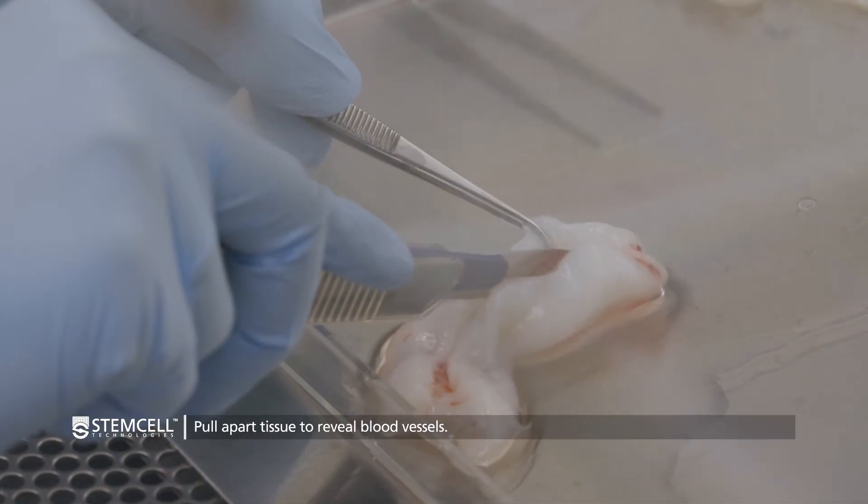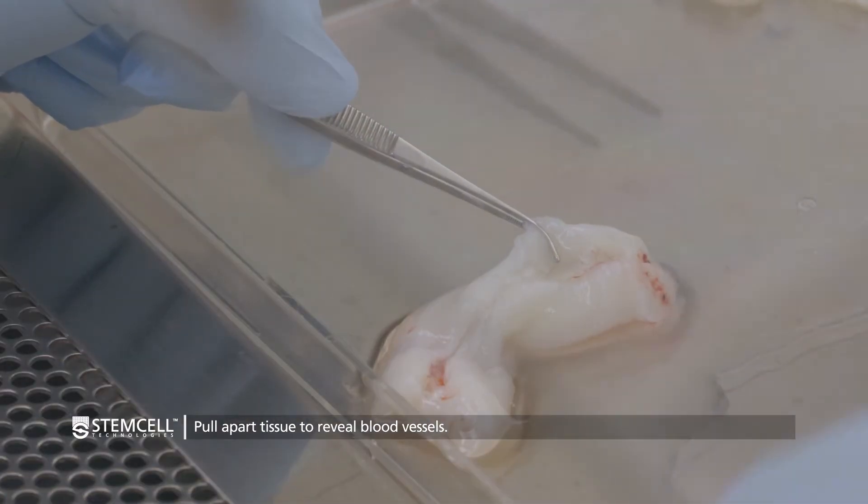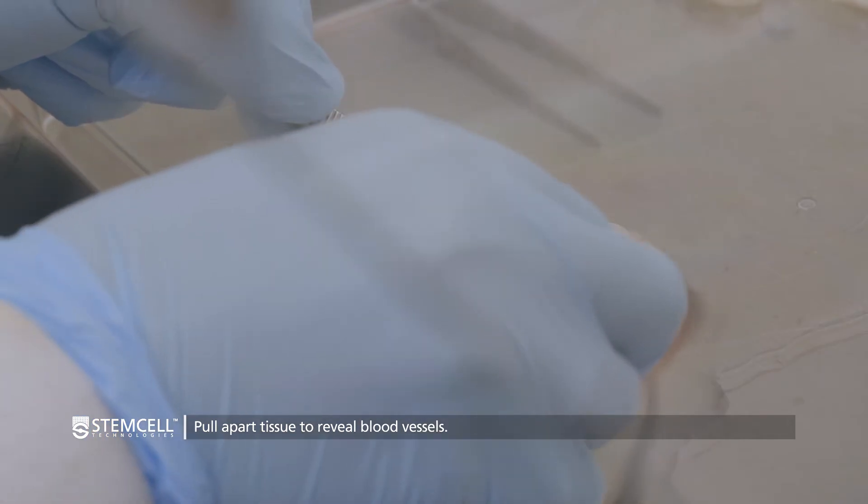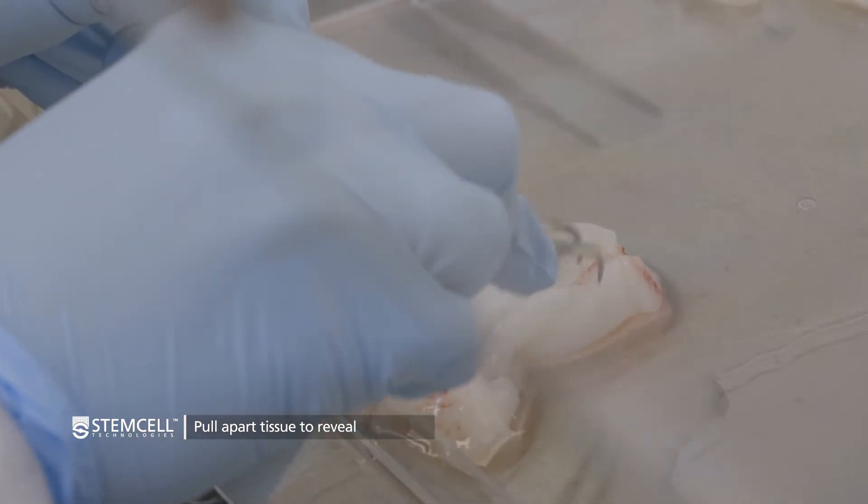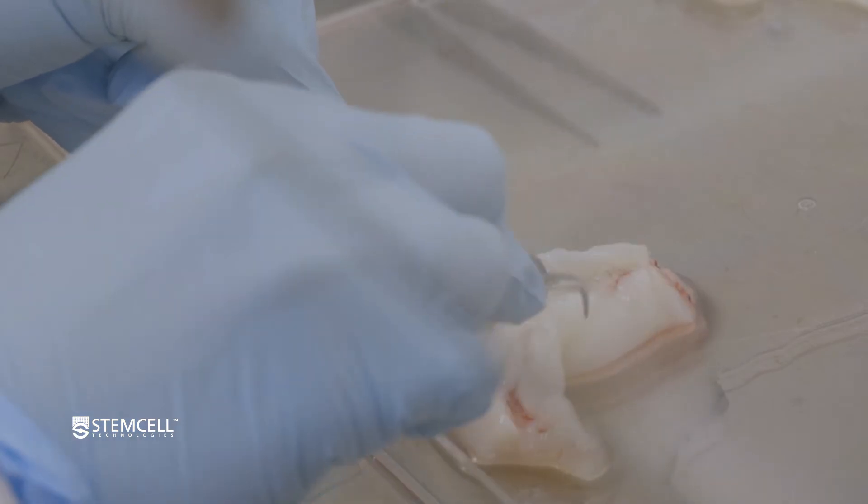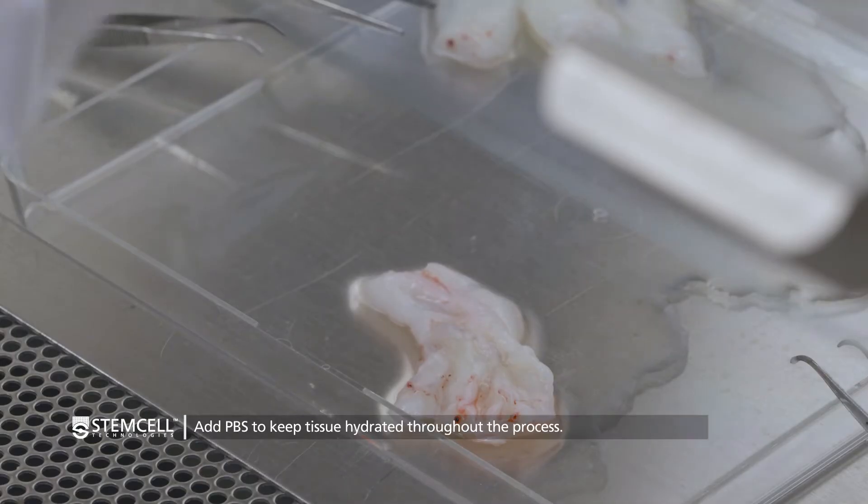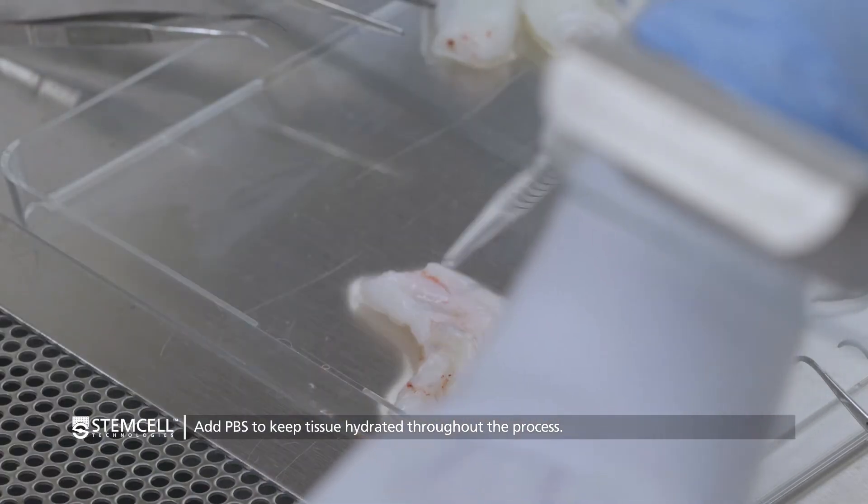Do this one section at a time. After the incision is made, the tissue can be pulled apart to reveal the vessels. This requires some force as the tissue is tough connective tissue. Throughout this process, add PBS as needed to keep the tissue hydrated.